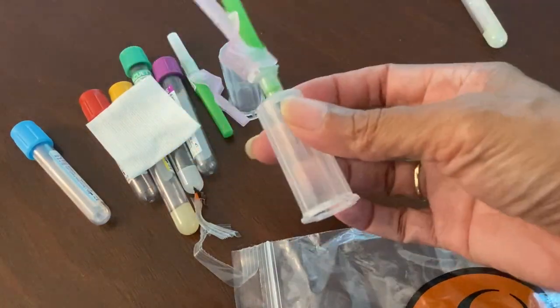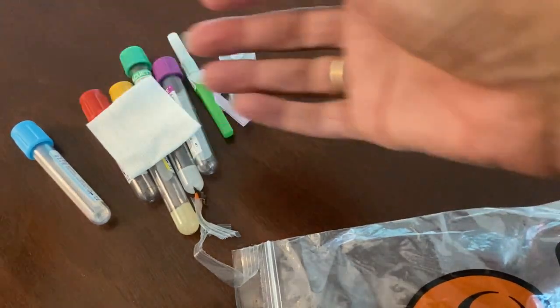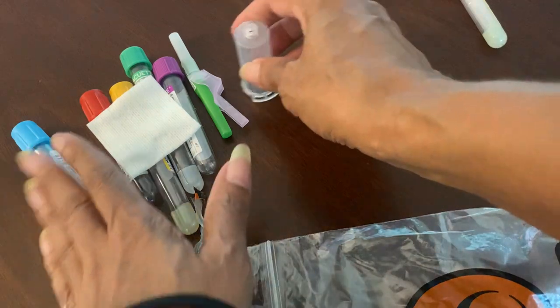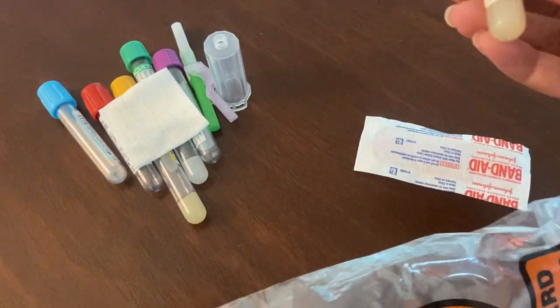The reason I have this out is because I have played around with this needle so much that I know it is contaminated. Because I'm going to do a quick stick, I don't want to use this one — that one's for show. I'm going to use the one out of this bag to show you guys the stick.